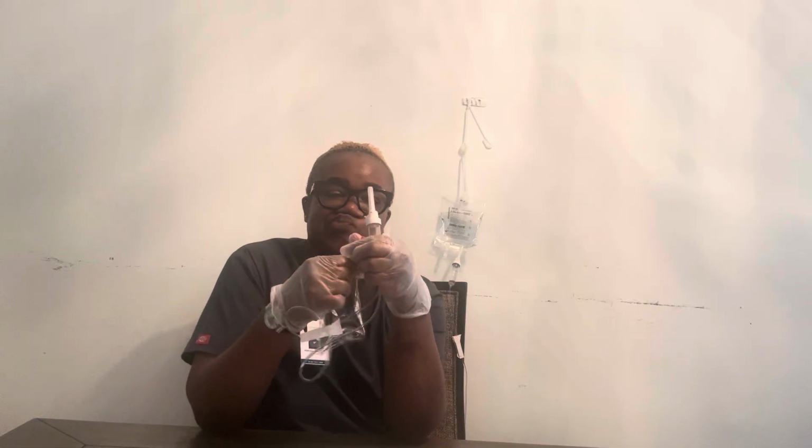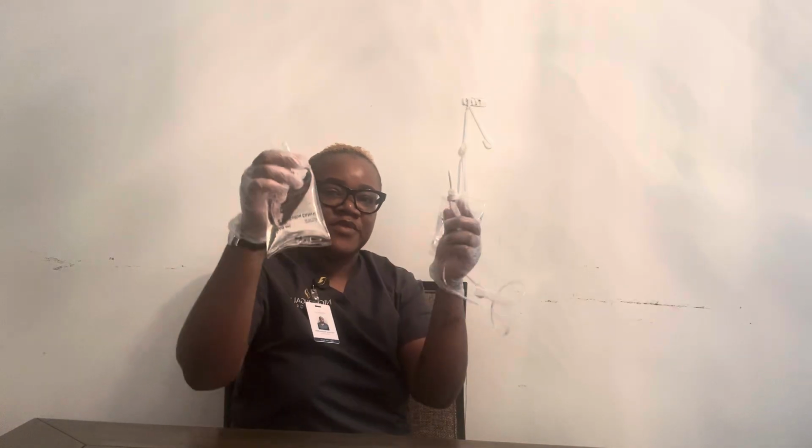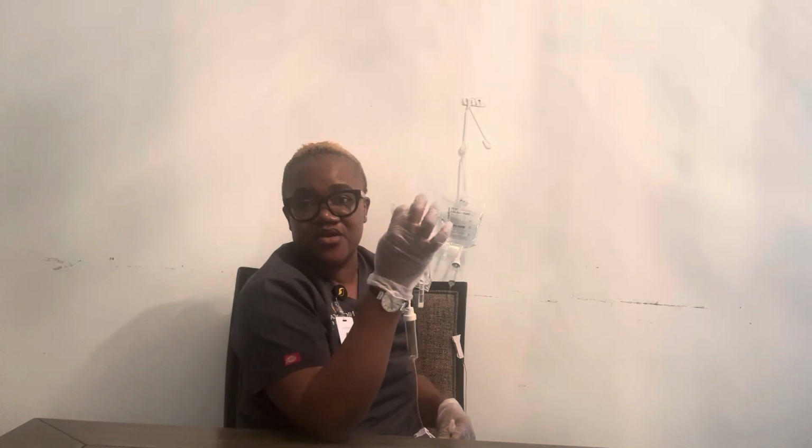and this is gonna be running at 20 drops per ml. So I am gonna do the same thing. I'm gonna remove this, and then I'm gonna open the spike, and then I'm gonna go ahead and spike my bag. And of course I'm gonna make sure that the line is closed. And I am gonna hang this above my primary bag, and I have to ensure that both my amoxicillin and my primary fluid is hung at least 30 inches above the patient's IV site.